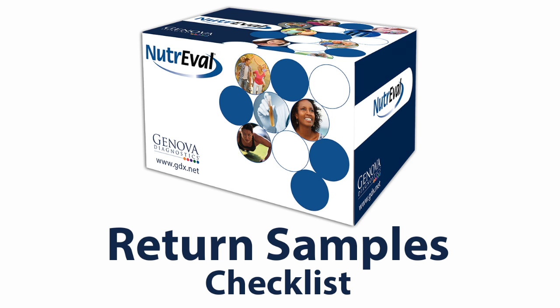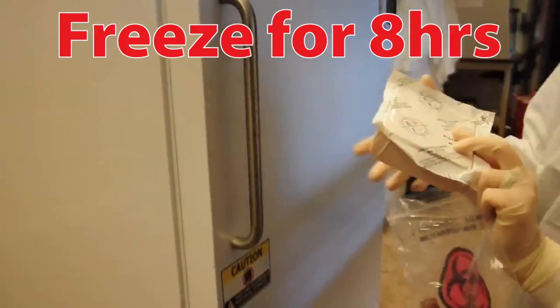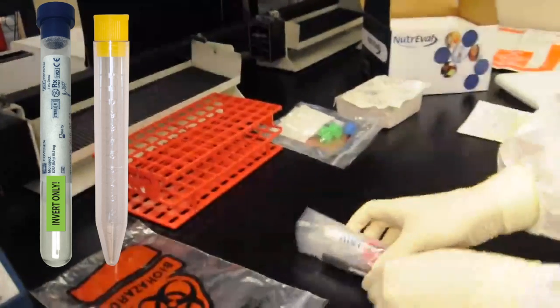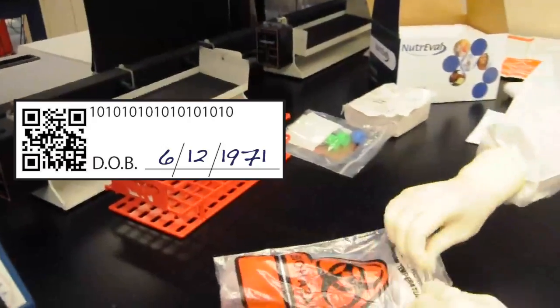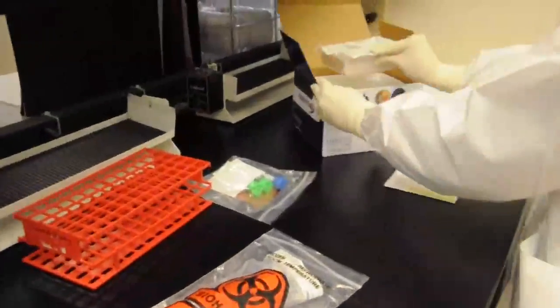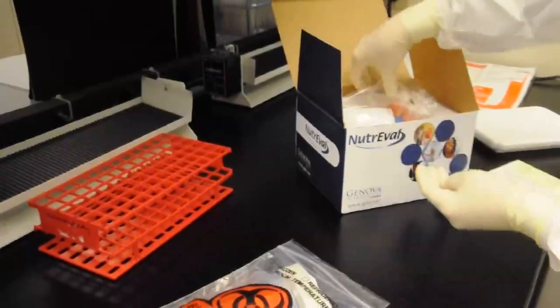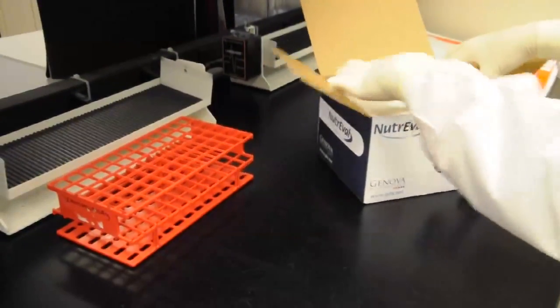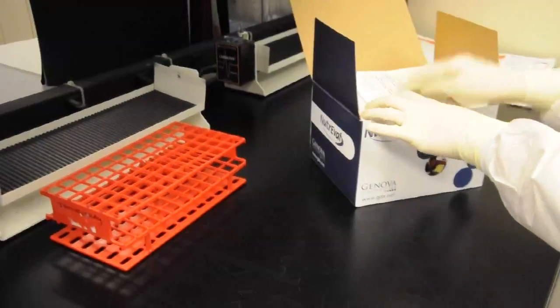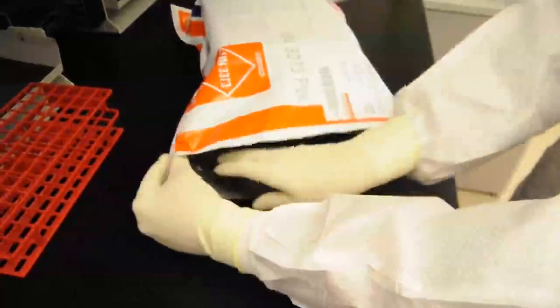This concludes the blood processing portion of the test. Now let's review the return checklist. Freeze the freezer brick for at least 8 hours prior to shipping specimens back to the lab. When returning specimens to the lab, be sure to include the blood specimens and two urine specimens. Make sure the tubes are tightly closed and identified with completed labels. Place the freezer brick inside the polyfoam box that came with the kit. Place the biohazard bag and vial sleeve containing blood samples on top of the freezer brick. Make sure that the completed and signed requisition is between the foam box and the test box. Place the box in the provided FedEx envelope and seal it.